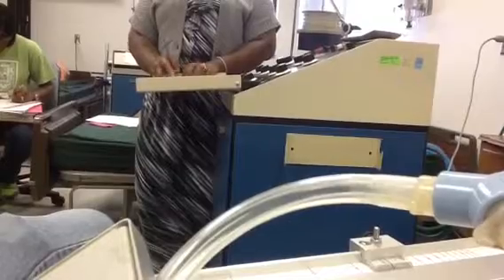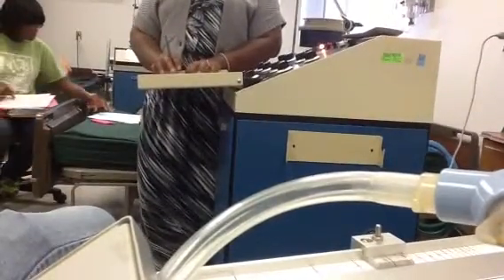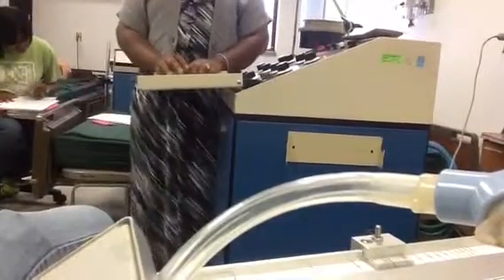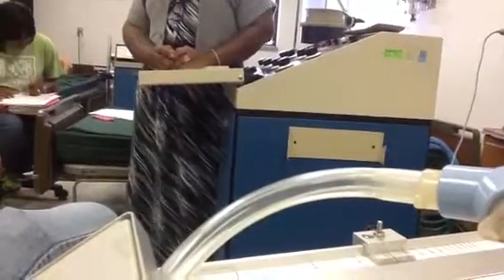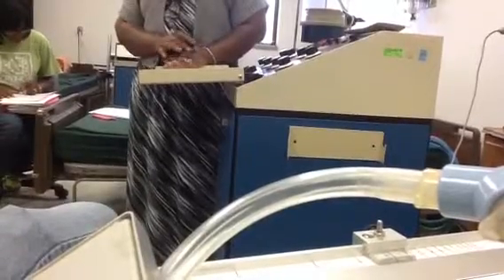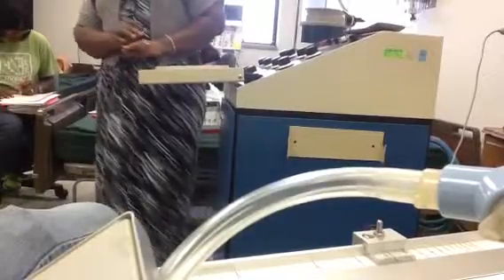So how would you get your rate? Count. There you go. Well, according to my sheet right here, you count. Spontaneous rate plus what? It says spontaneous rate plus set rate, or assisted rate plus set rate.